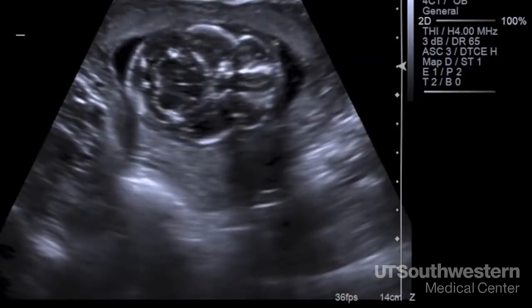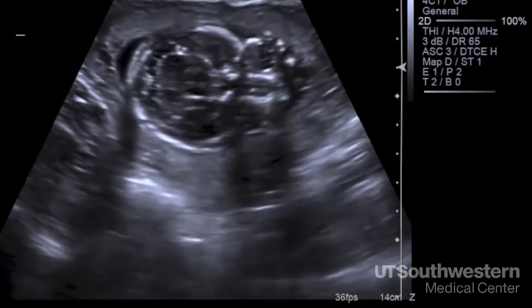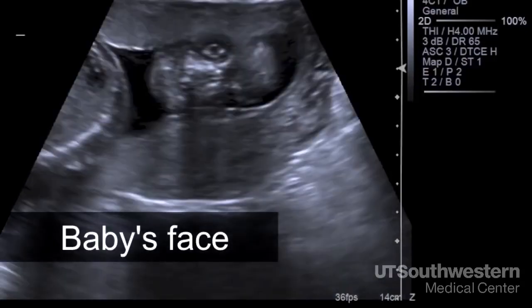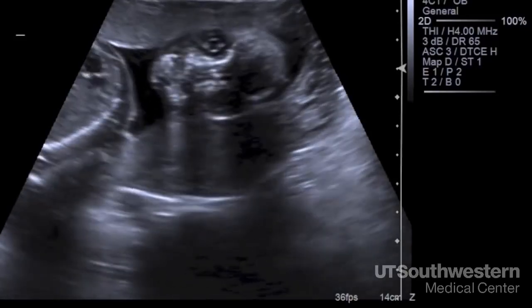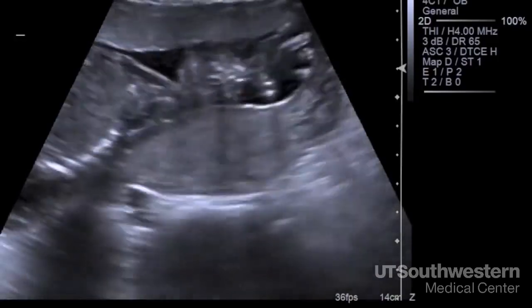In this view, we also measure the thickness of the skin at the back of the neck. It can be increased in some chromosome abnormalities like Down syndrome. Here we're looking directly at the face, which looks more like a skull. There just isn't much fat yet on the face. Within the eye socket, you can see something that looks like a bubble. It's the lens of the eye.